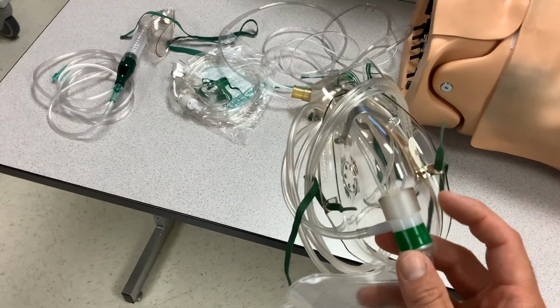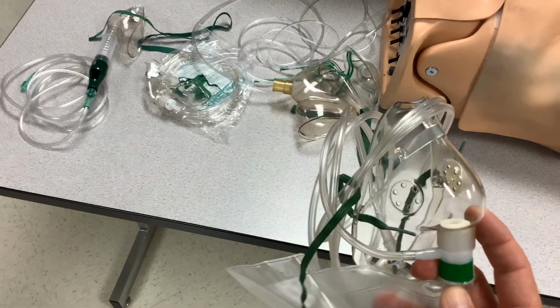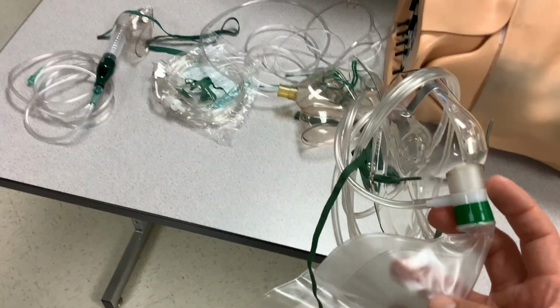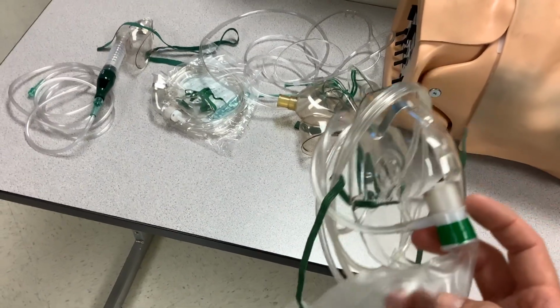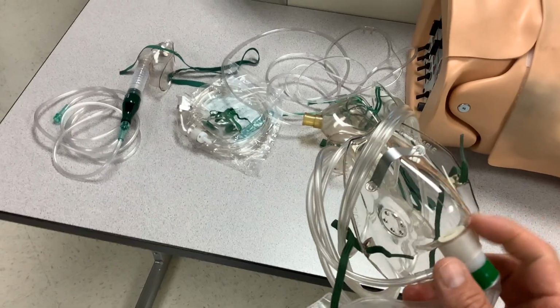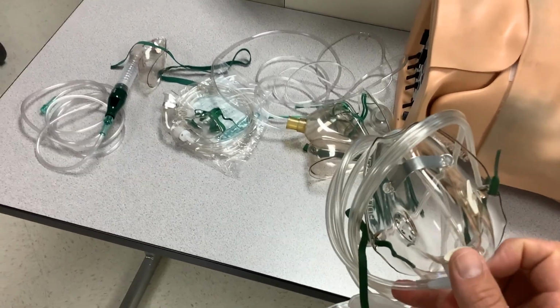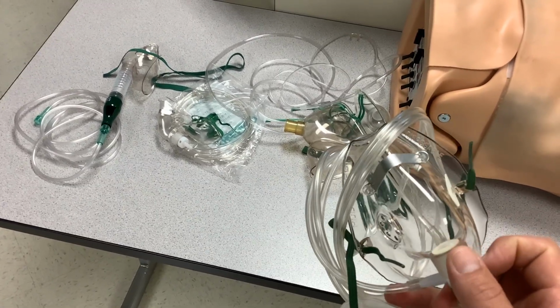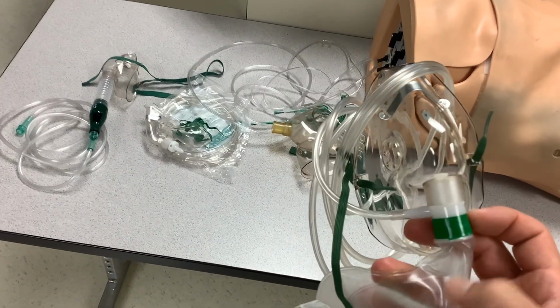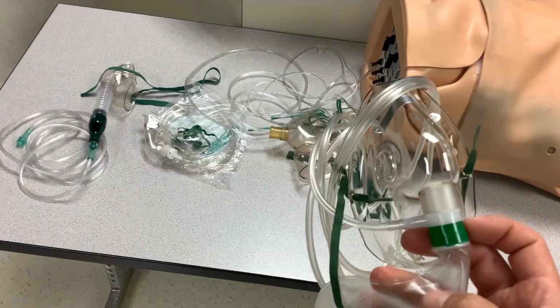So ultimately, when the patient breathes in, this valve here will open, and that will allow as close to 100% or 100% oxygen that's in the reservoir bag to be breathed into the patient's mouth and nose. And then when the patient exhales, this valve closes so that there's not any exhaled CO2 or exhaled gas going into this bag. It's fresh 100% oxygen.